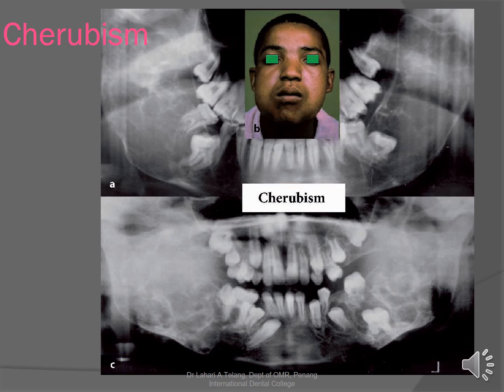And then you see the image of this patient from how it was in A, where it looks very radiolucent, and then it goes to B, and C, where it is quite radio opaque. So that could be different stages of the disease, and the disease is progressing.